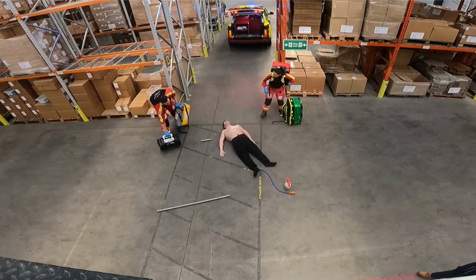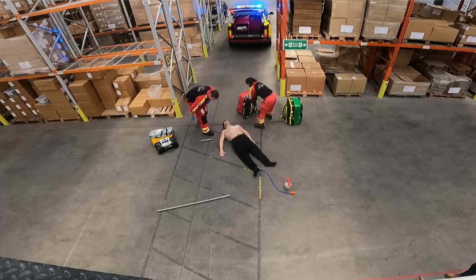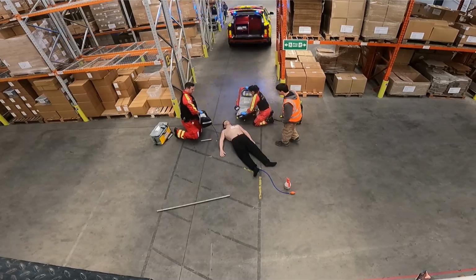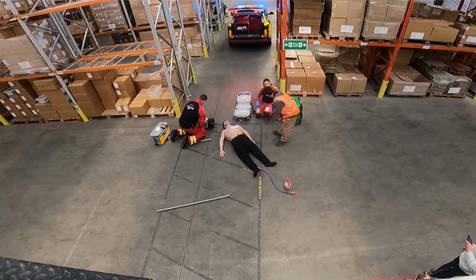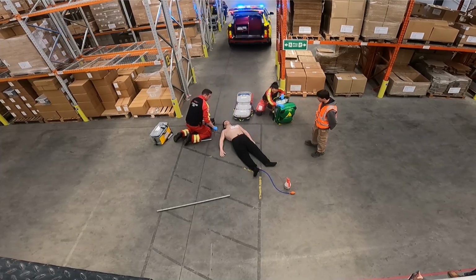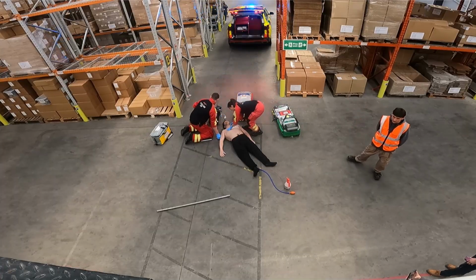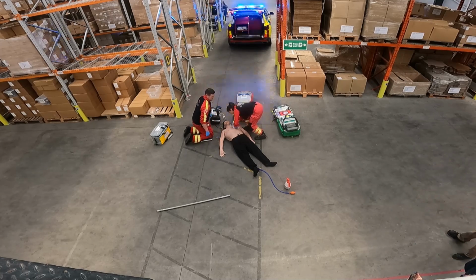Hello, boss. Here we go. Hello. My name's, I'm one of the doctors. So you've got a patient very quiet, lying on the ground, breathing very quickly. You're going to do a quick assessment of the casualty, put on some monitoring, make sure there's no other catastrophic wounds or any life-threatening injuries that the patient may have sustained through the incident.